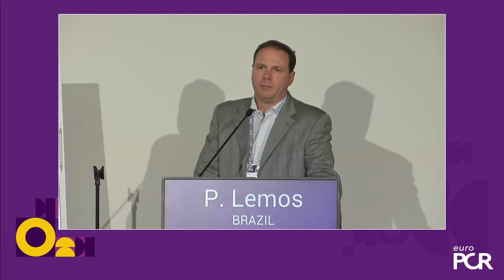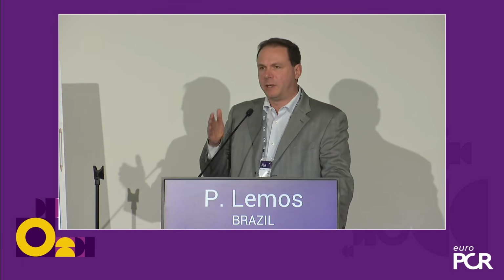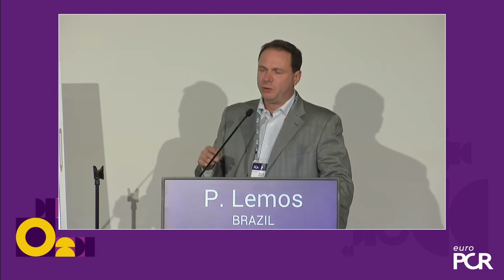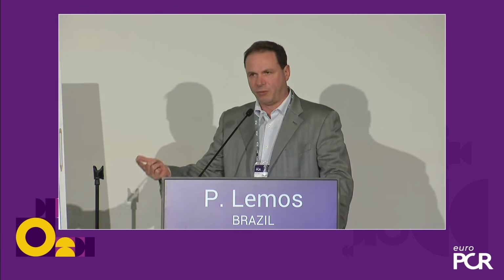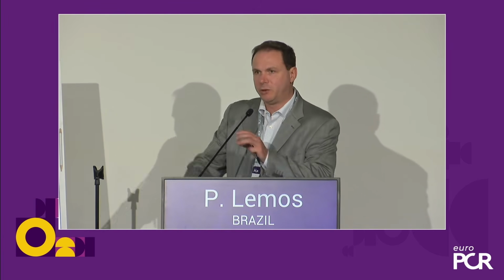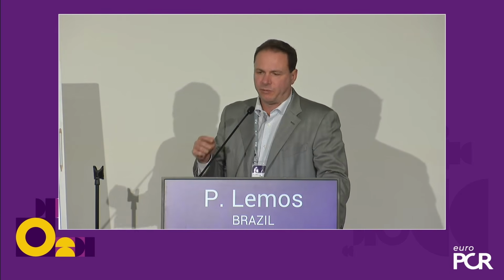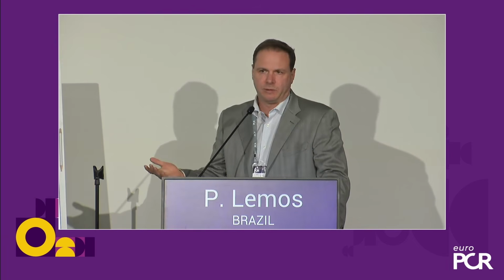Just from a pure scientific point of view, we wanted to test a pure DCB plus IVL type of scenario. In practice, very often we do cutting balloon or non-compliant balloon before the drug-coating balloon. So in the trial, we excluded these patients because we didn't want to confound the results. But in practice, it's very common for us to do IVL, then complete lesion preparation with another type of balloon, non-compliant or cutting.